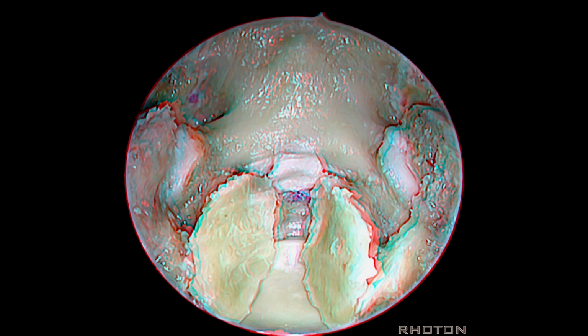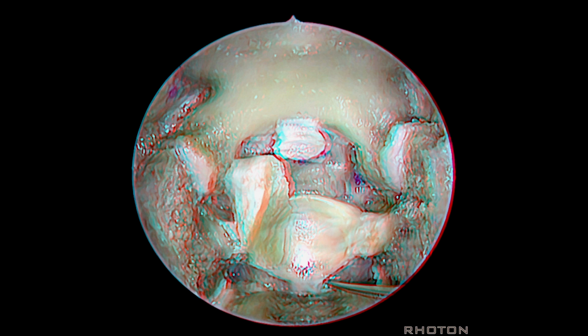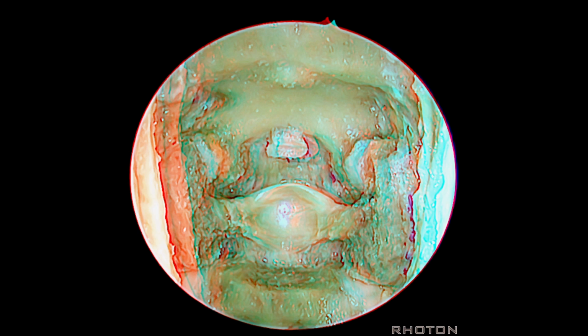You're looking up between the alar ligaments, while transnasally again, you see the lower slit above the resected odontoid, the lower slit here of the cruciform ligament.